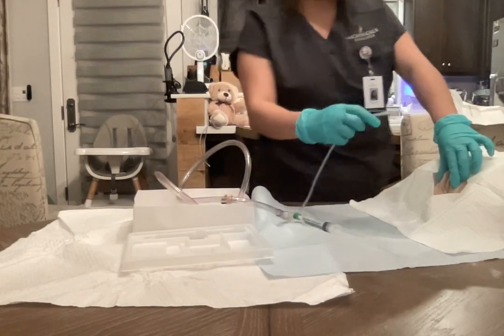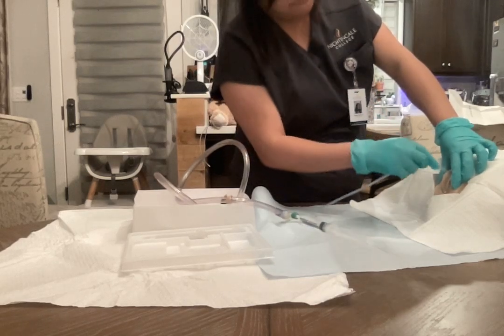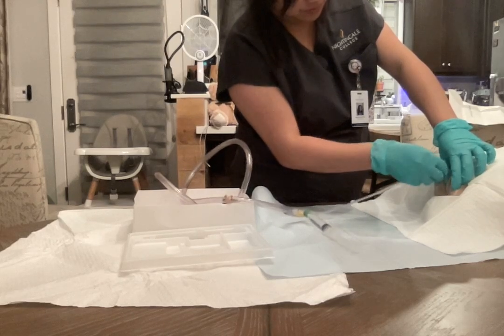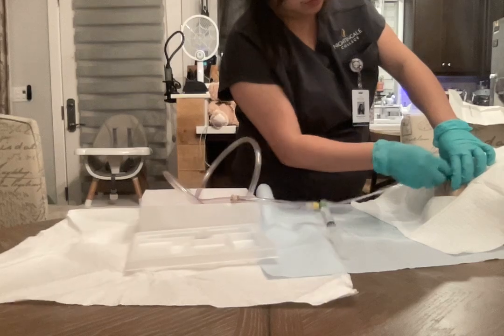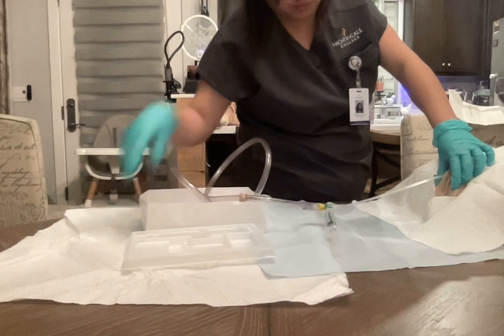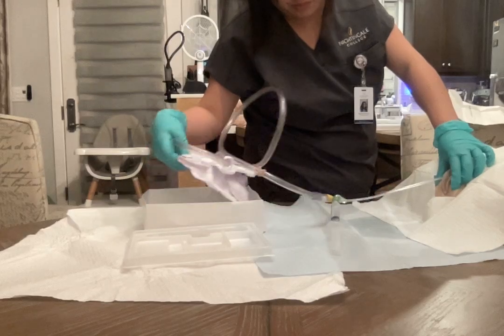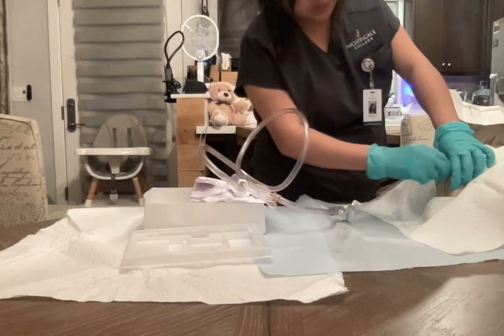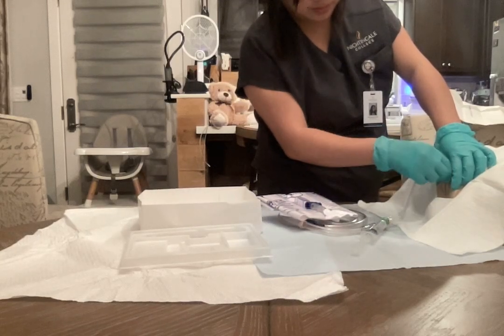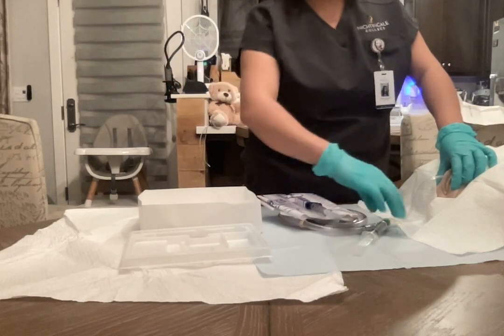Okay, now I'm going to insert the catheter, and please take a deep breath, and on the exhale we're going to insert it. Okay, I'll advance the catheter another 2 inches after seeing urine. Okay, now I'm going to inflate the balloon to secure the catheter in place.